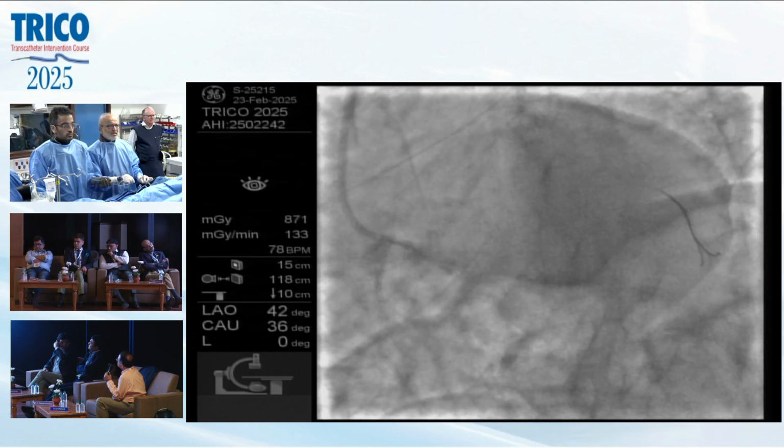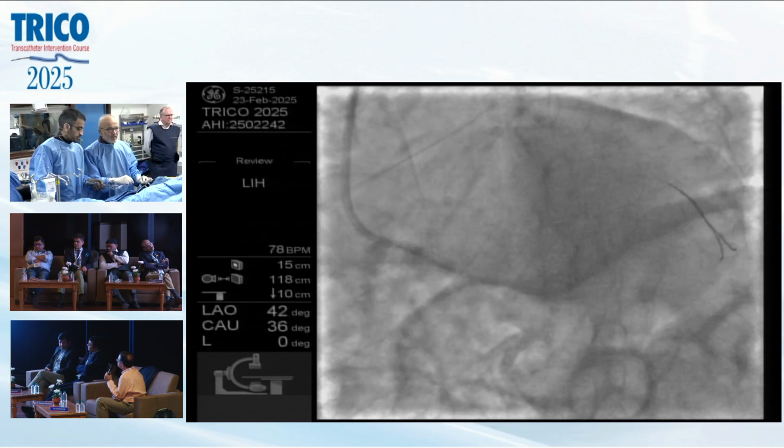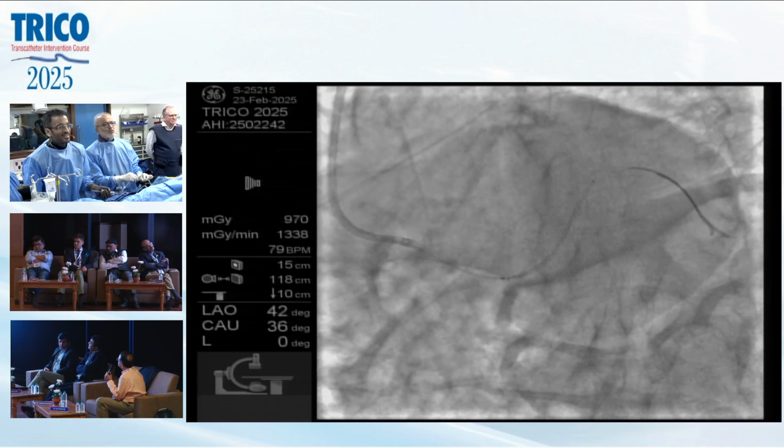This stent, when I feel that nothing goes in, I have found that this goes in. This is one product which I love to use.